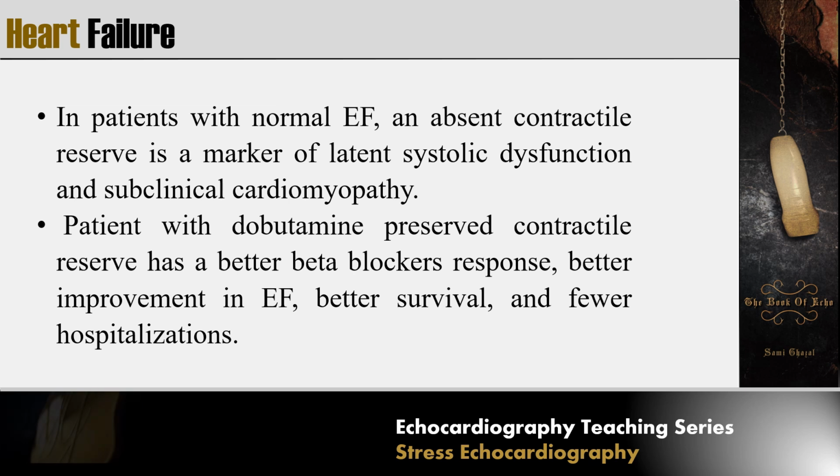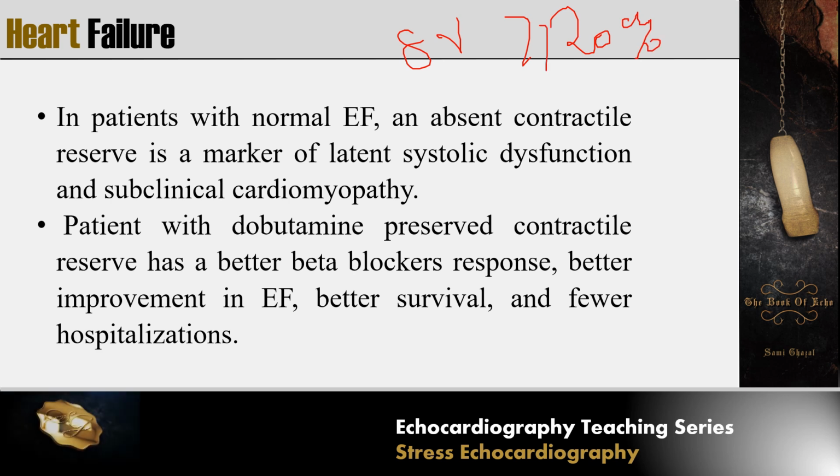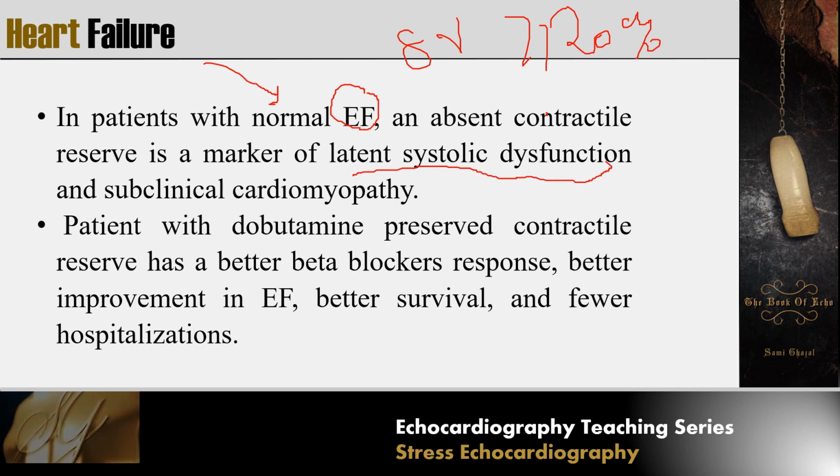Now, flow reserve is something else. It's defined as an increase in stroke volume of more than or equal to 20%, and we use that flow reserve in aortic stenosis and low gradient severe aortic stenosis. So now, in a patient with heart failure and normal EF, absent contractile reserve is a marker of latent systolic dysfunction and subclinical cardiomyopathy. So something is cooking.